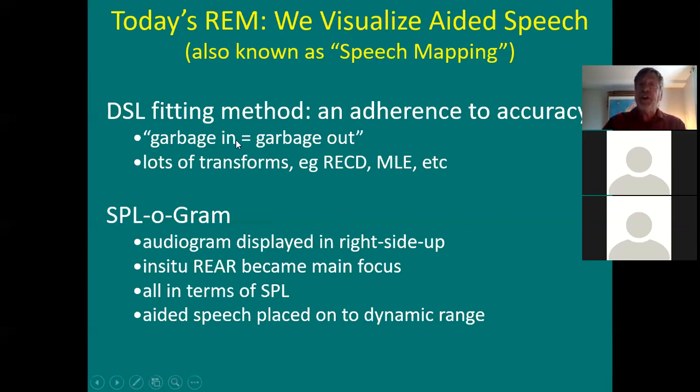DSL said garbage in is garbage out. If you build your house on sand, it's going to fall when the winds come. So they have lots of transforms: real ear to coupler difference, mic location effect, and all these things are added to the hearing loss in order to transfer it from dB HL to dB SPL.